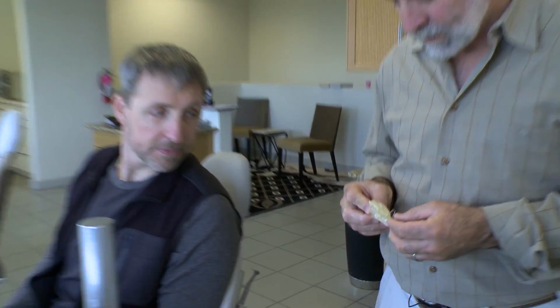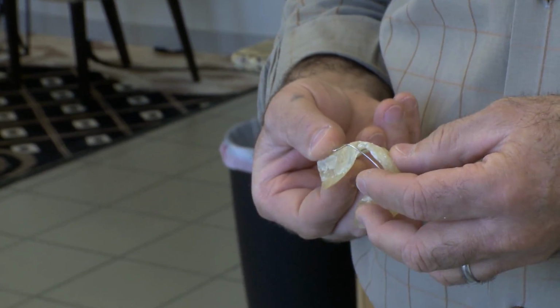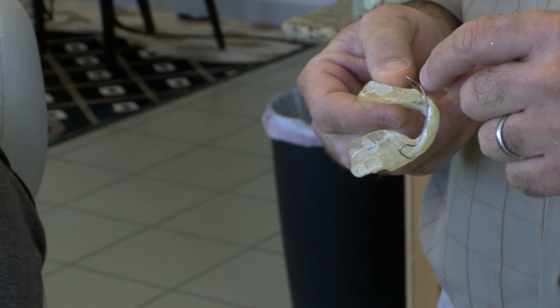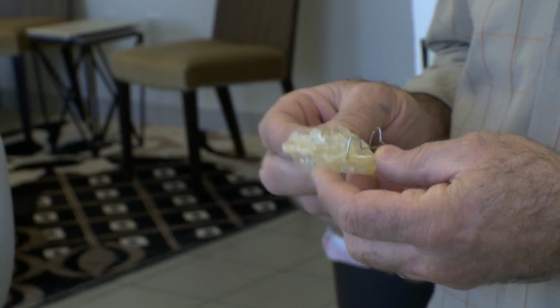So Dave's night appliance was broken, and he put some rebar in it, and then we'll work it over. He cut the wire to take any stress off the system while we repair it.